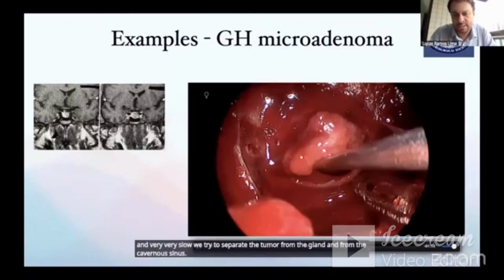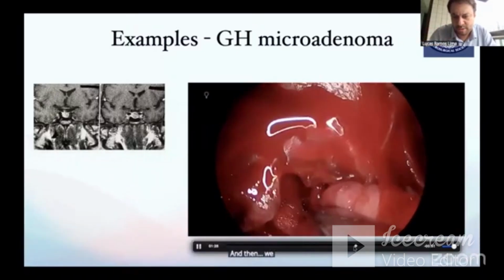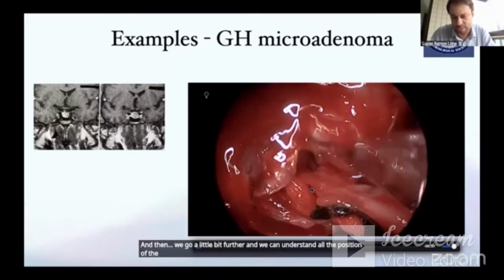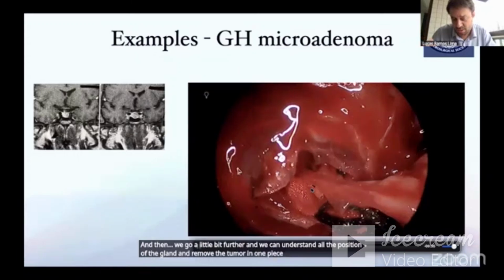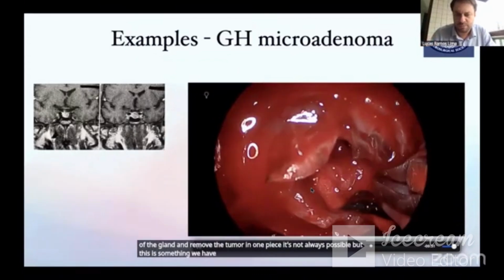And then we go a little bit further, and we can understand all the position of the gland and remove the tumor in one piece. It's not always possible, but this is something we have space for, and we have to try to do it.